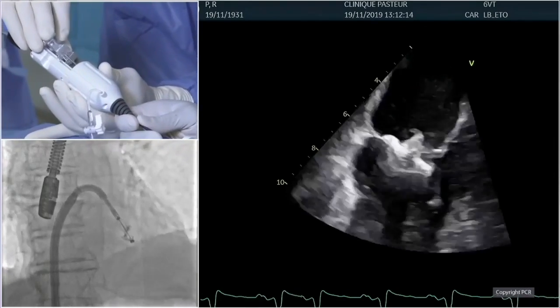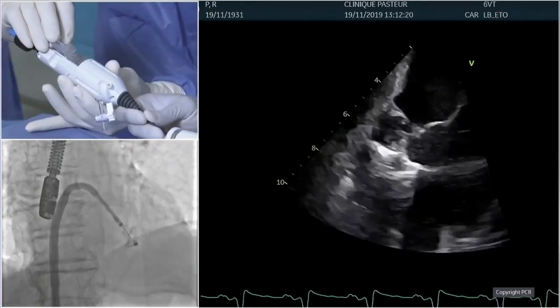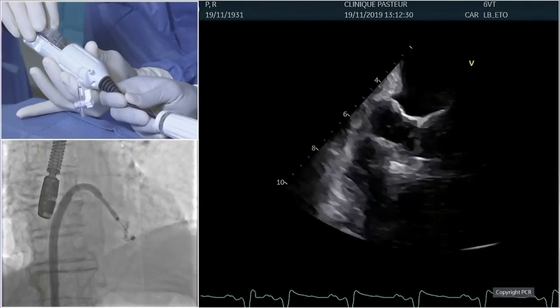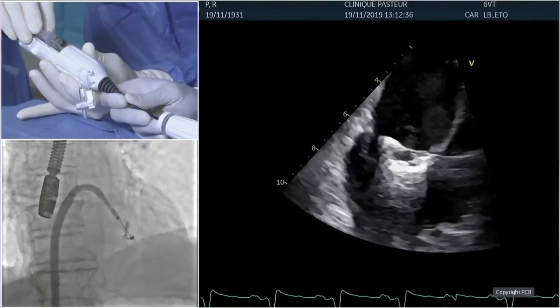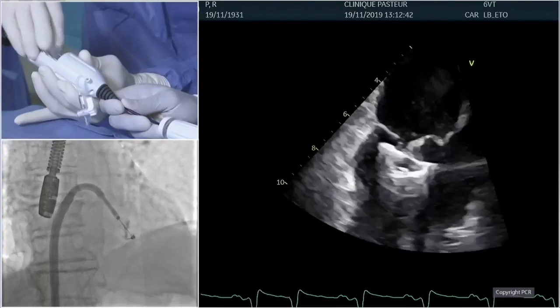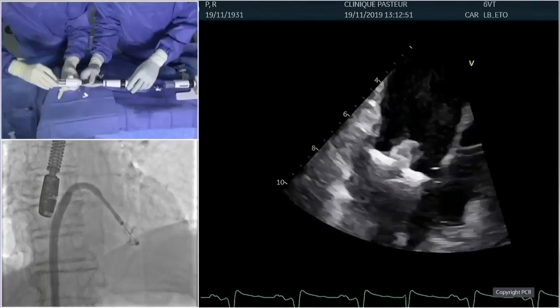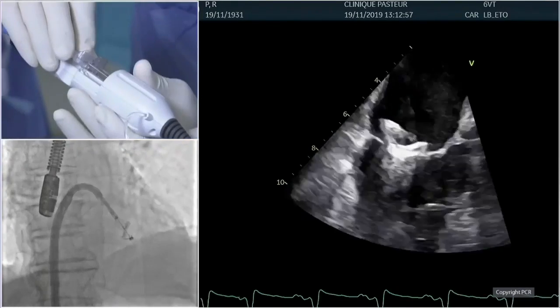Okay, so let's lift. No, the posture is not the same. Longer. Okay, so let's load first the posterior. I'm going to move a little bit anterior. Okay, try to keep the image still. Okay, clasps down. And both clasps down, yeah. No, we did not see them going down. Yeah. Okay, so let's go a little bit like that. Okay, so we are up.